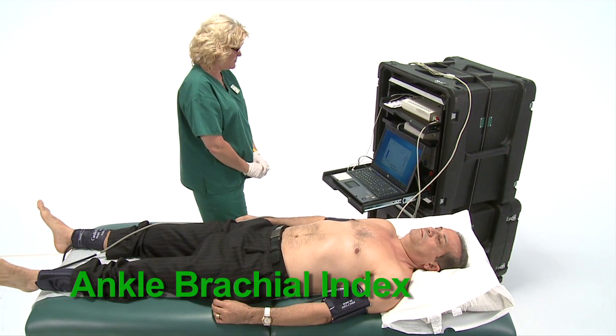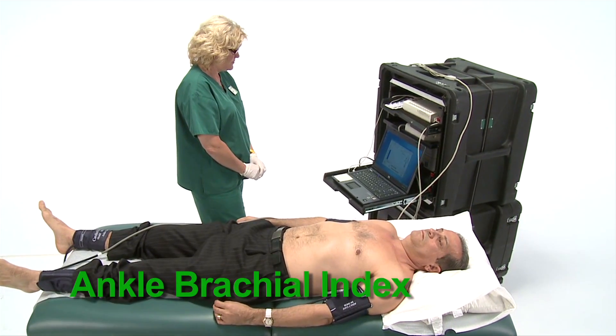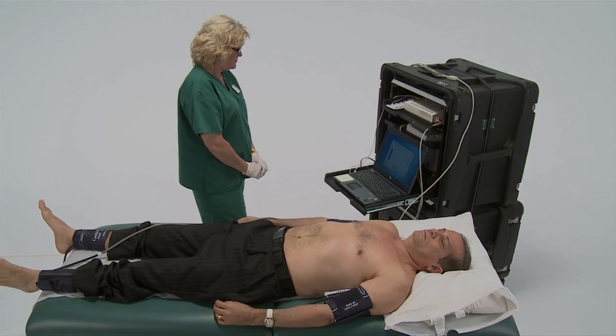The Ankle Brachial Index Test compares your blood pressure measured at your ankle with your blood pressure measured at your arm.